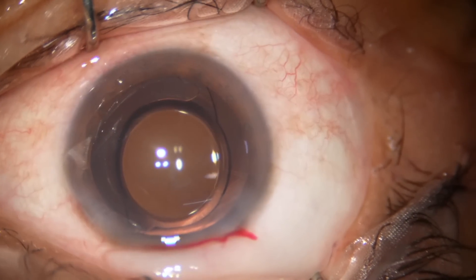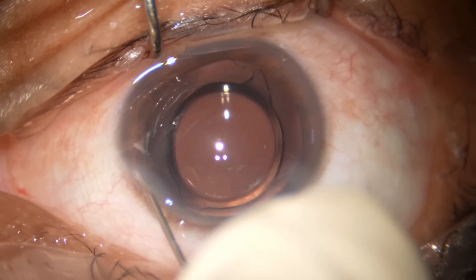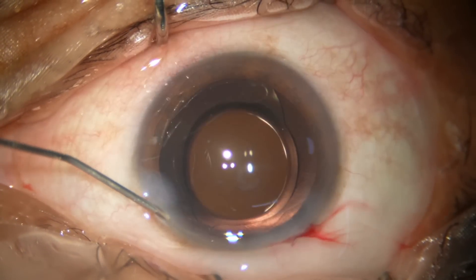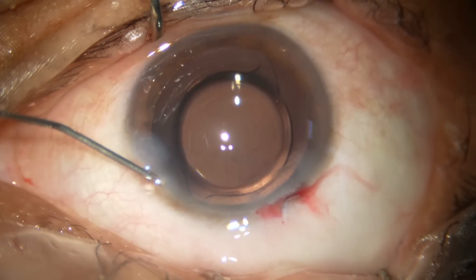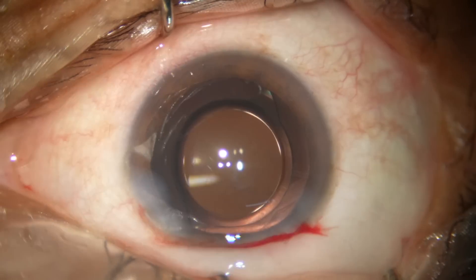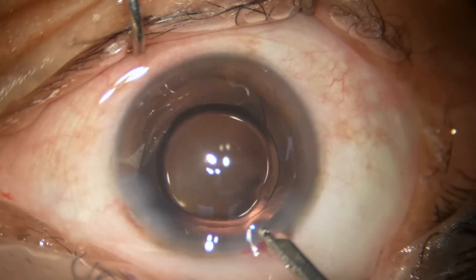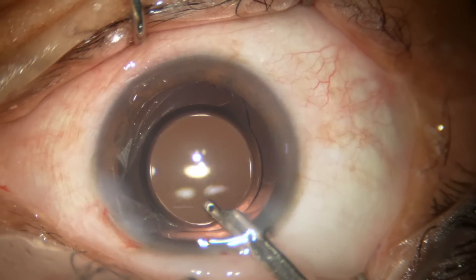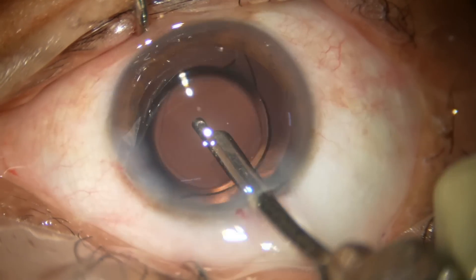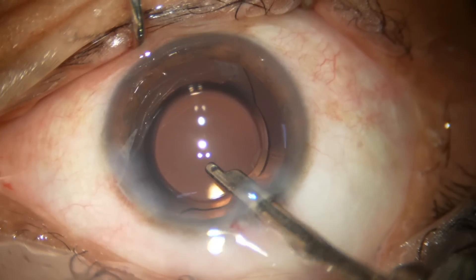This is a bolus of moxifloxacin. Hydrating the side port — the corneal stroma is hydrated and the side port gets closed. Now the final lavage of the anterior chamber. The haptics are fully open now and the lens is stable.